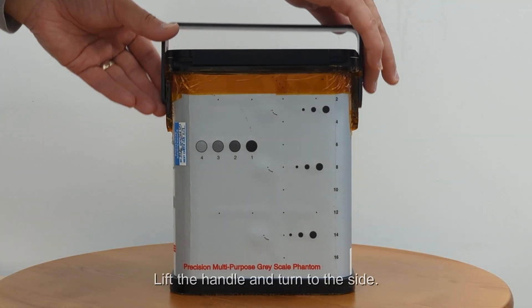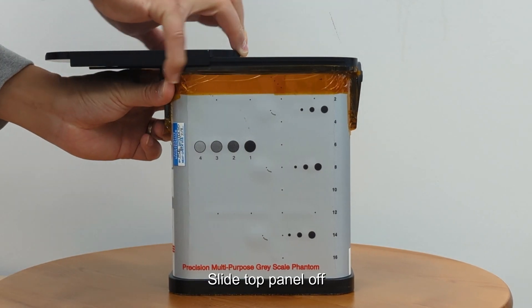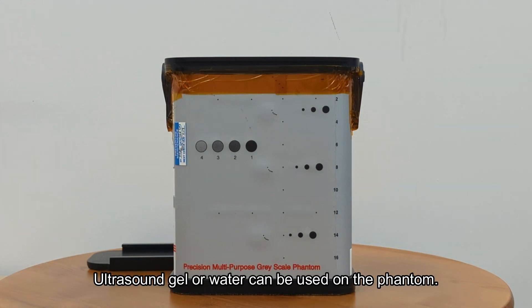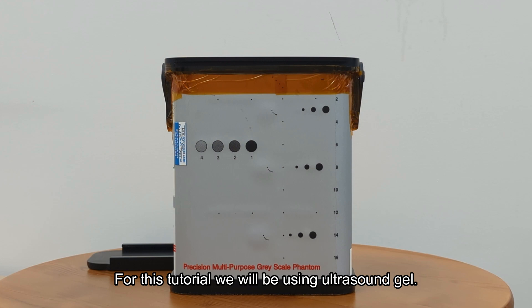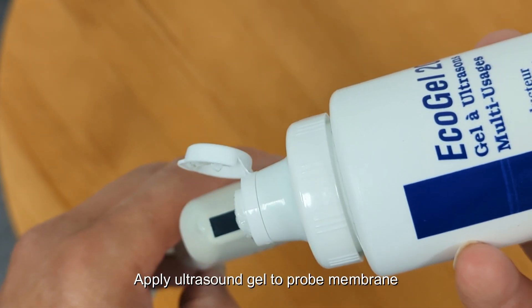Lift the handle and turn to the side, then slide the top panel off. Ultrasound gel or water can be used on the phantom. For this tutorial we will be using ultrasound gel. Apply ultrasound gel to the probe membrane.